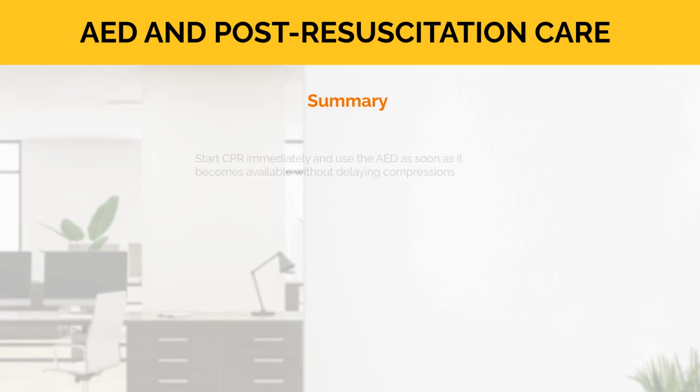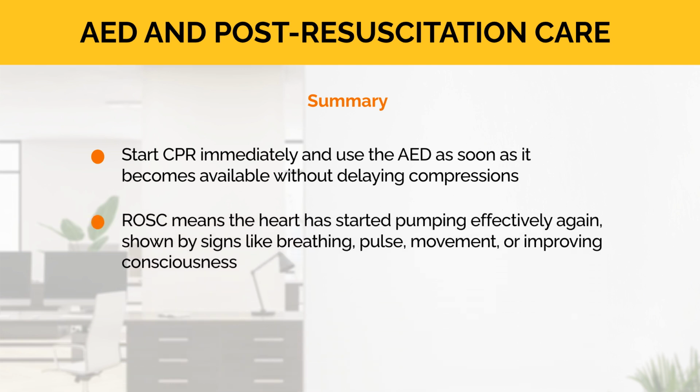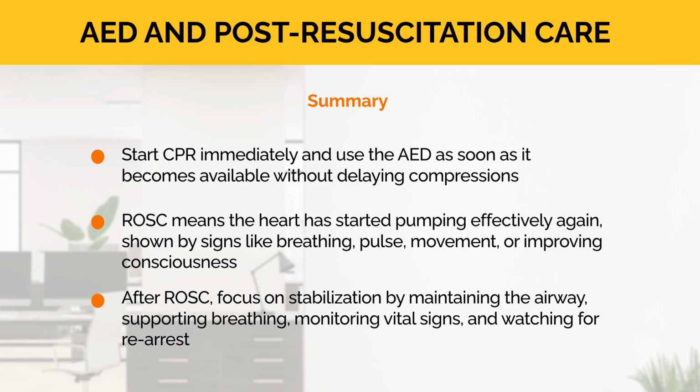In summary, start CPR immediately and use the AED as soon as it becomes available without delaying compressions. ROSC means the heart has started pumping effectively again, shown by signs like breathing, pulse, movement, or improving consciousness. After ROSC, focus on stabilization by maintaining the airway, supporting breathing, monitoring vital signs, and watching for rearrest.